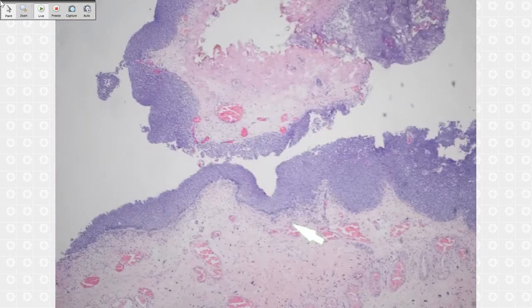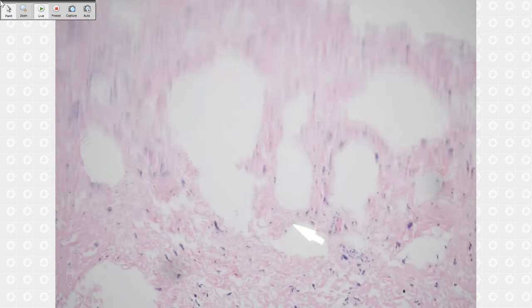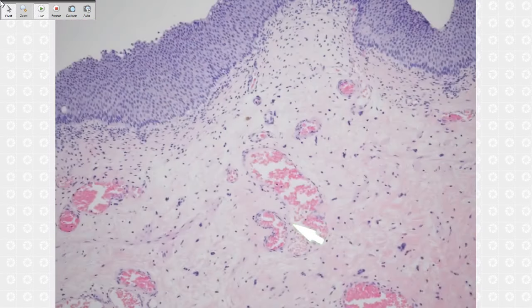Then I'm going to show you another one. I will go back, it's okay. I will show another one. This is a case from, I think, 2 weeks ago. It's here again. This biopsy, right? Bladder biopsy. I don't know if it's a TURBT, but it looks like we got a big chunk of tissue. You see, agree, this is a papillary lesion, right?